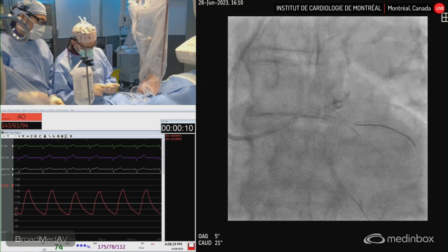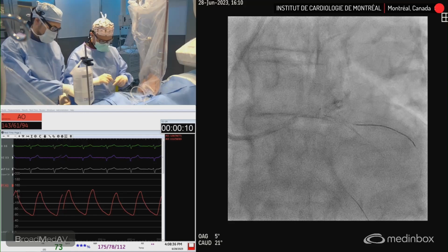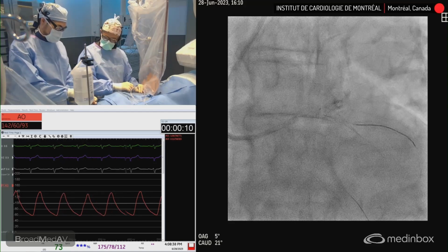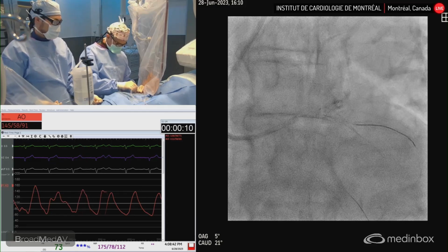So my eyesight is getting very bad, you know. I can't put the balloon. Okay. Finally got the balloon. You're good. It's getting difficult. I gotta say, I wonder if I'm developing radiation cataracts. No. Too young.